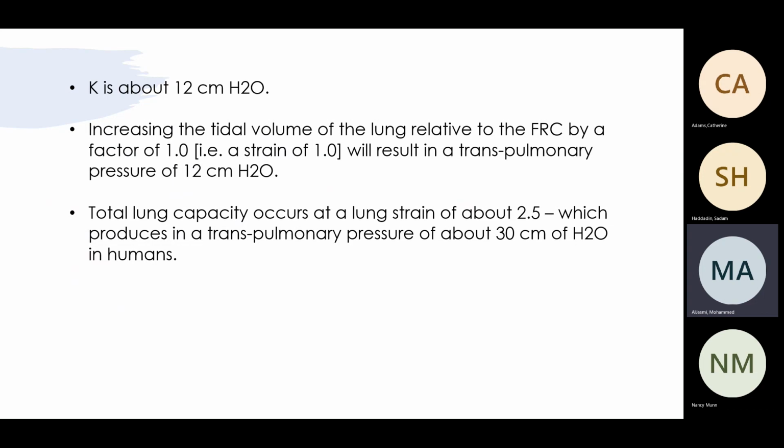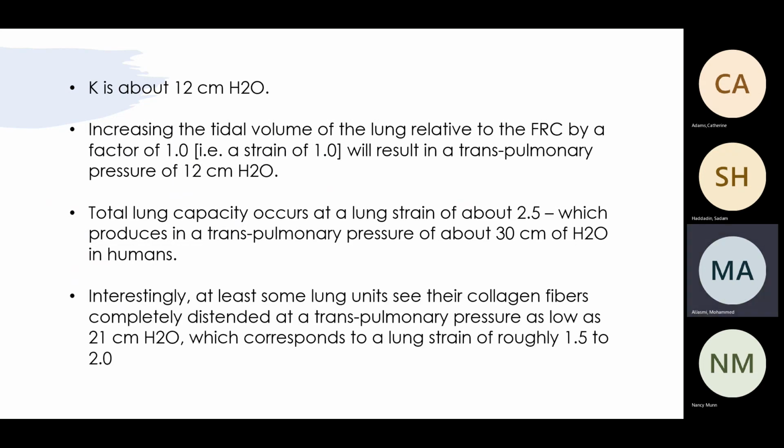They did another study and found that to have all the lung units, not all, you cannot do that, but at least most of the lung units, with strain and stress away from barotrauma or volutrauma, you want it to be around 21.